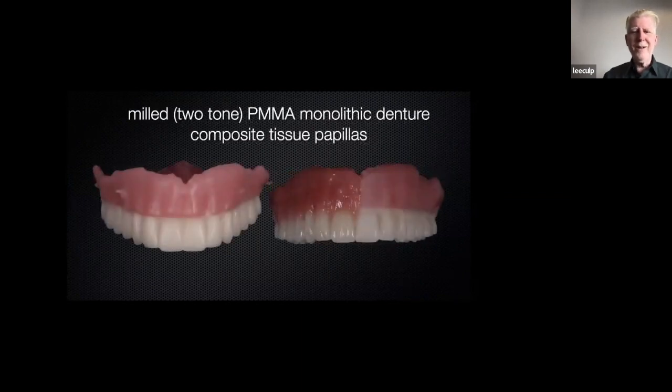Now, before Ivoclar came out with their red pink disc, there was another one out there, but it was a severe line between pink and white. It was either pink or it was white. They didn't go into each other to do tooth forms. So we tried that too. We had to get it positioned perfectly, and then come back with composite and add papillas and around the margins a little bit. You can see there's a definitive line between red and white, and you would have to fill that in a little bit.